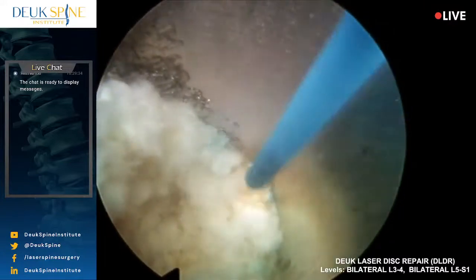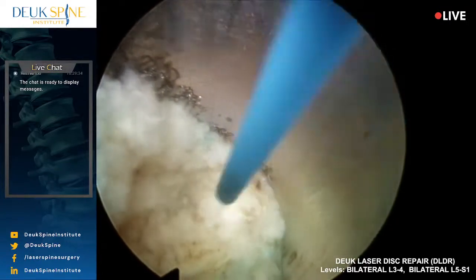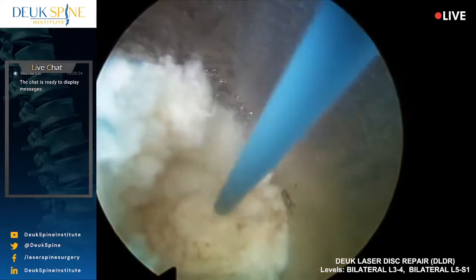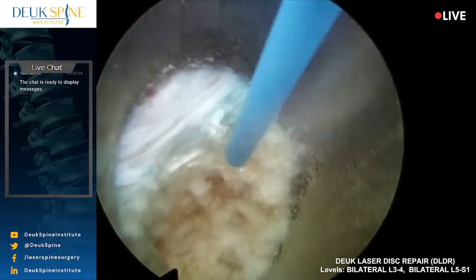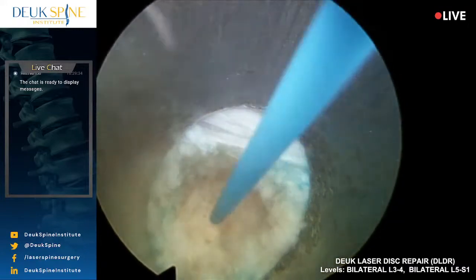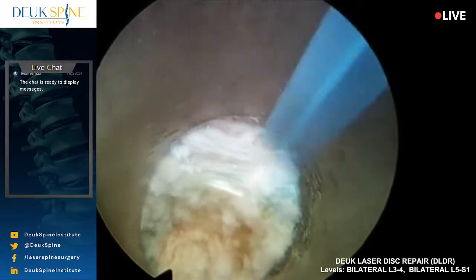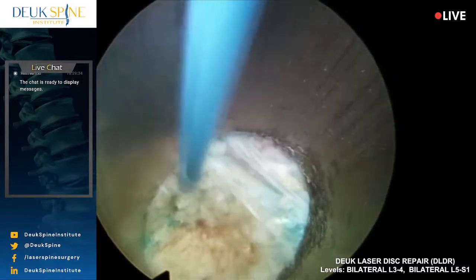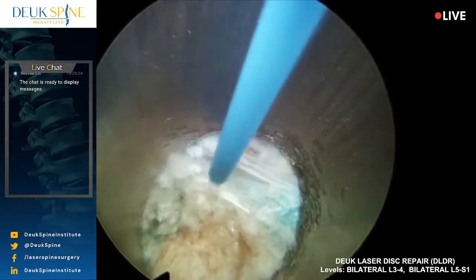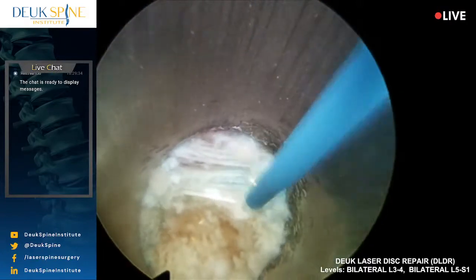This area over here is lateral in the disc herniation. Just to orient you, the laser fiber is covered in blue plastic, and it's in the lateral part of the disc right now. And this patient has a very big herniation here. So I want to get lateral as well to make sure I don't leave anything behind that could hit the nerve as it leaves the spine and goes down to the pelvic area. This is one of the sciatic nerve contributors. Of course, it's eventually going to come together in the pelvic region and travel down.